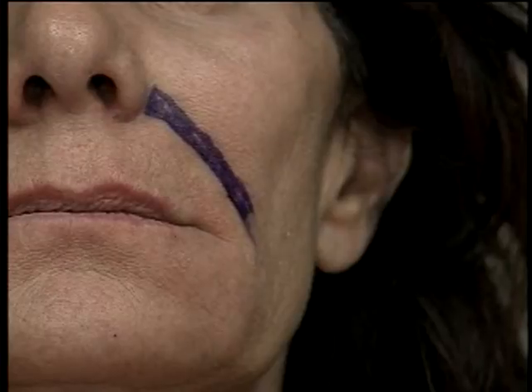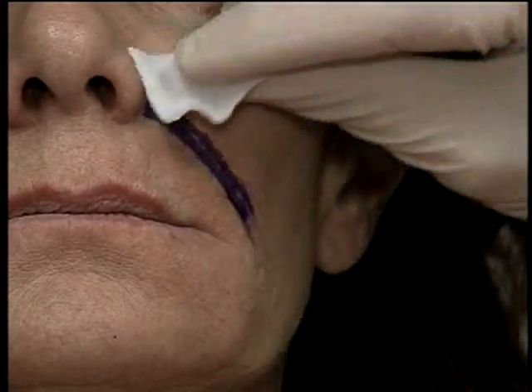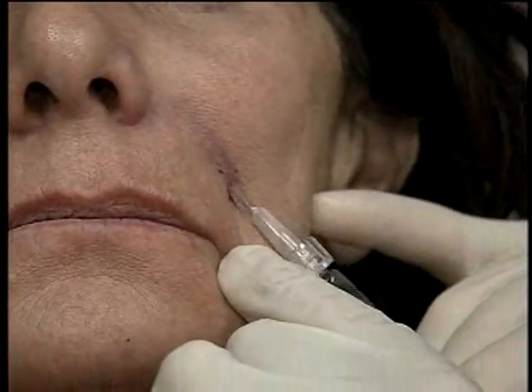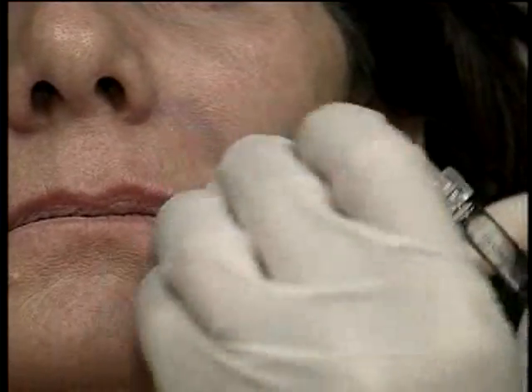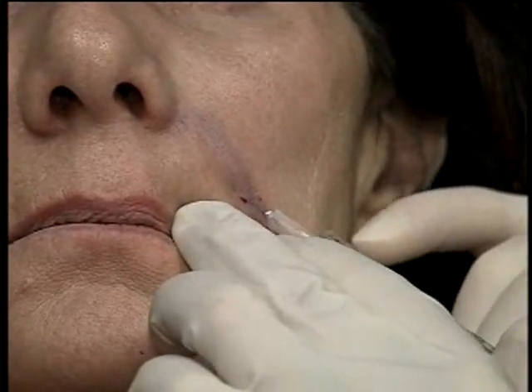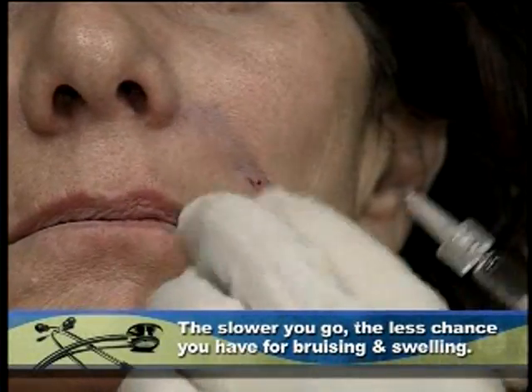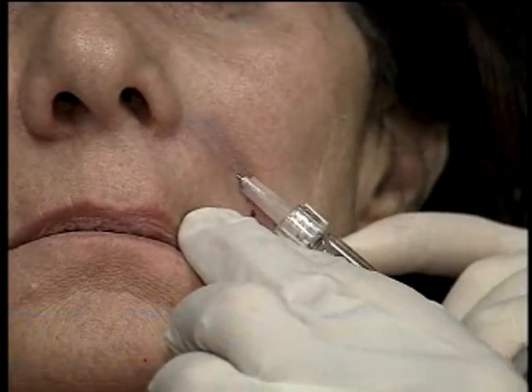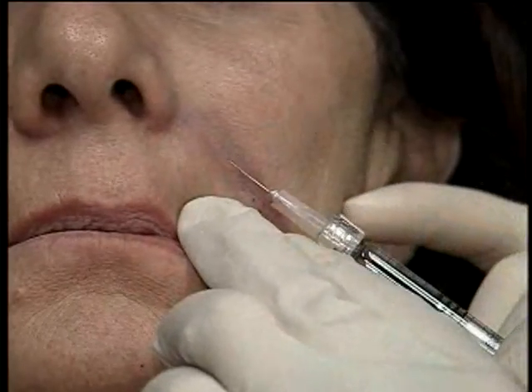I'm using an alcohol pen. Now I'm going to take off that blue mark, so that was just for demonstration purposes. It'll be a little bit easier for me to work if I can get that off. And I'm going to do a little fanning method. So I'm coming a little bit medial and a little bit lateral, and I'm going back and forth. Ideally you want to go slow. The slower you go, the less chance you have for bruising and swelling. So I'm moving back and forth, but I'm attempting to go at a slow pace, and this will get you a better result with less bruising and swelling.